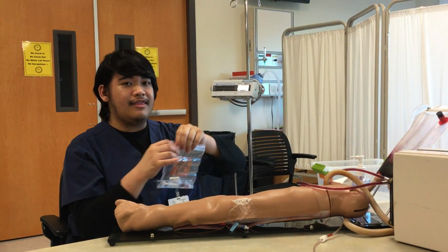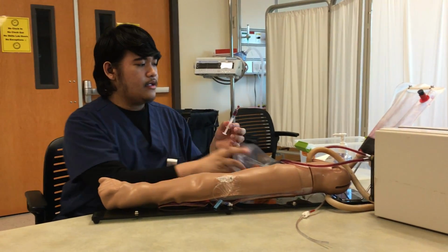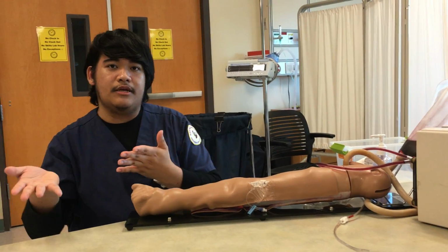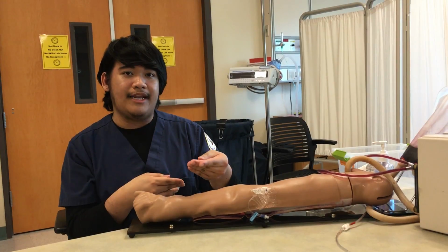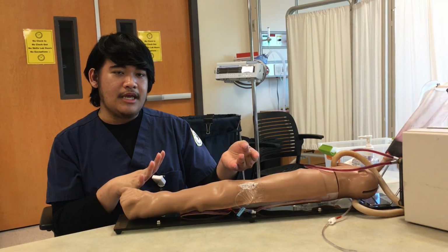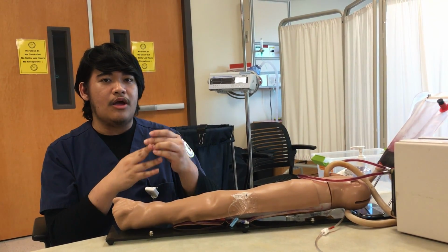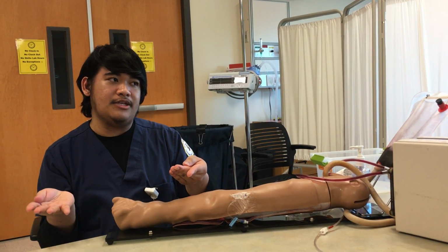And if I'm going to run this within the 15-minute range, I will go into the lab and put the blood into the analyzer, let the analyzer do its job, and once the analyzer has printed out the information, I would interpret it, and then I would create a modified care plan for the patient. Once I've done that, I will call the physician and let the physician know my interpretation and the results that the patient got from the ABG test.